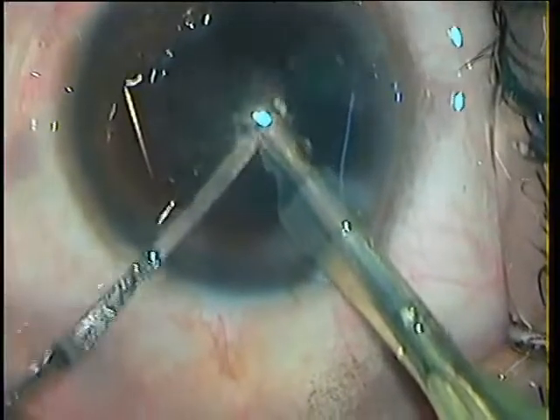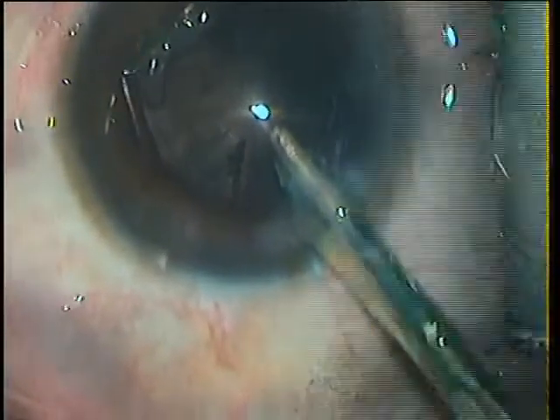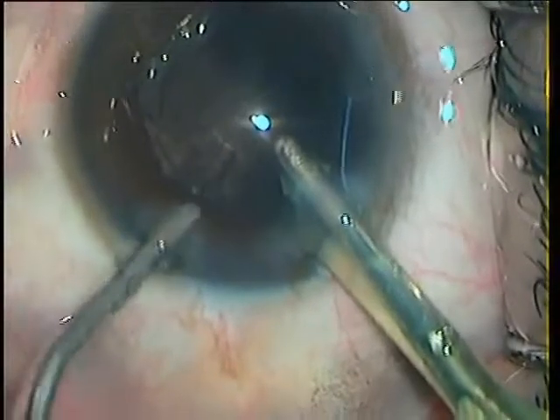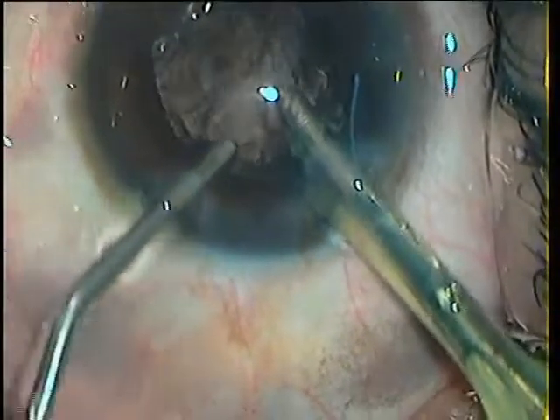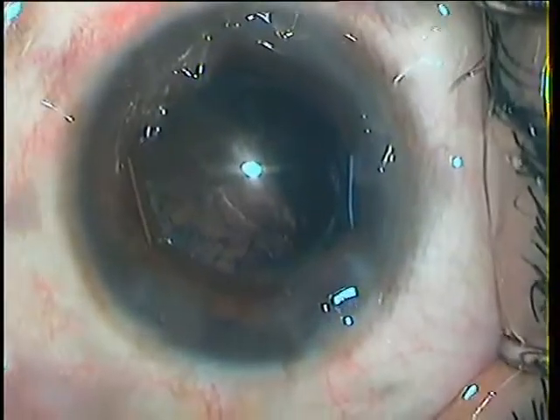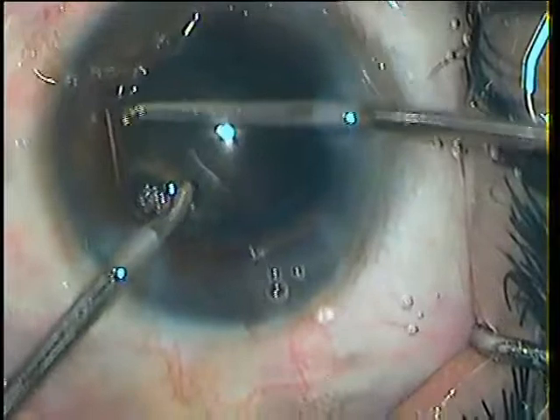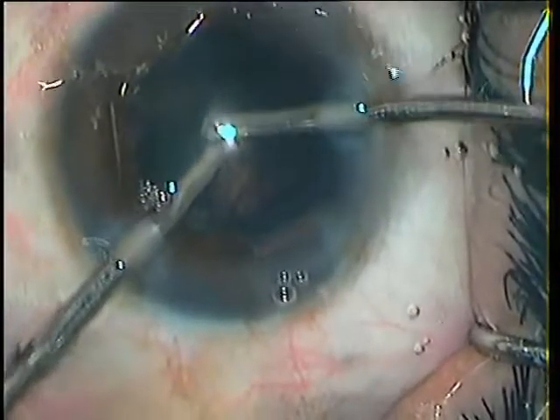I use an iris depositor towards the end. And before I take the probe out, I inject visco into the AC. Cortex removal is done by bimanual irrigation and aspiration.